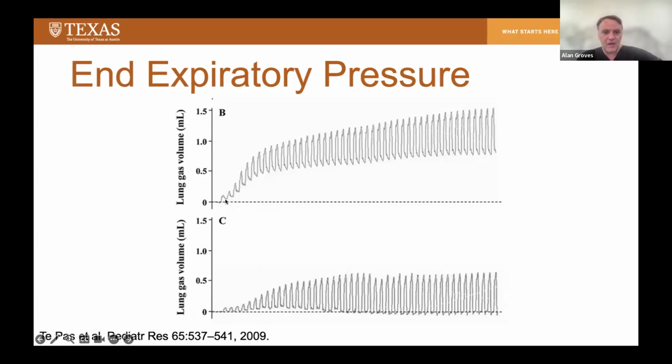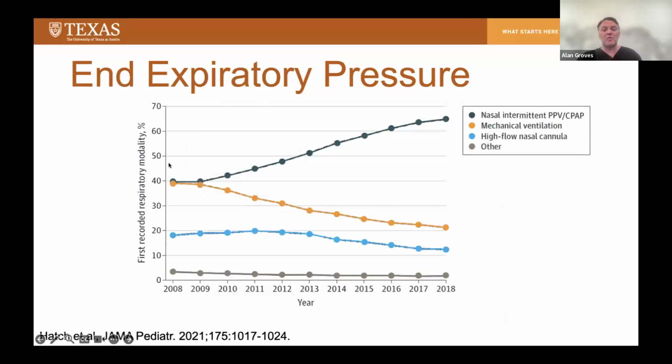And very compelling, of course, that with the addition of a PEEP, we are getting much better establishing of our FRC. And again, you all remember from your medical school hysteresis curves that by getting some FRC, this is the easiest position for babies to be breathing in. Having their lungs fully open like this dramatically decreases the work of breathing because they've already got some established FRC. So we all acknowledge, I think, that PEEP is key. We all acknowledge that we are talking about lung recruitment maneuvers whenever we're giving these things to our babies.